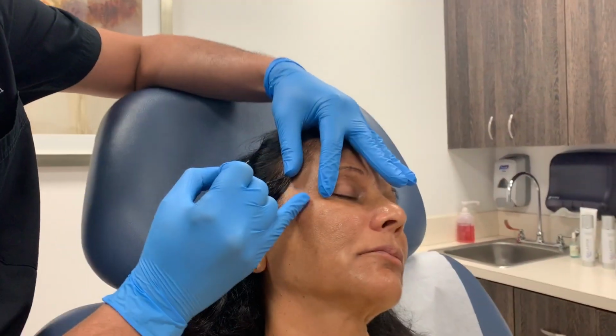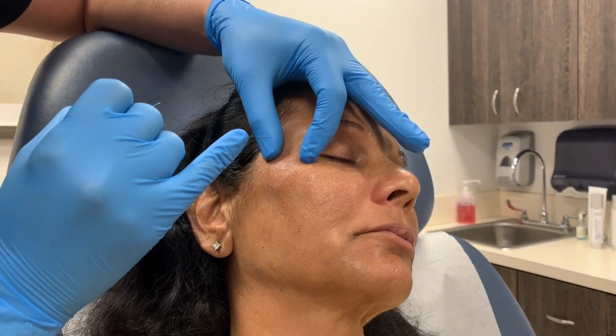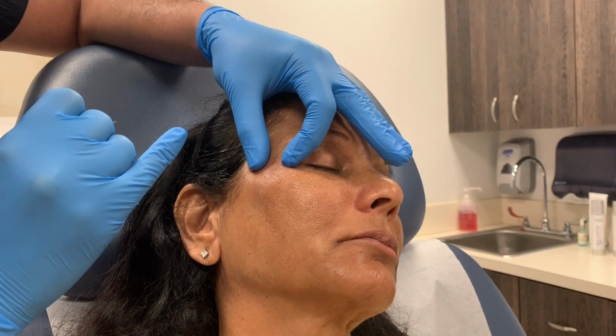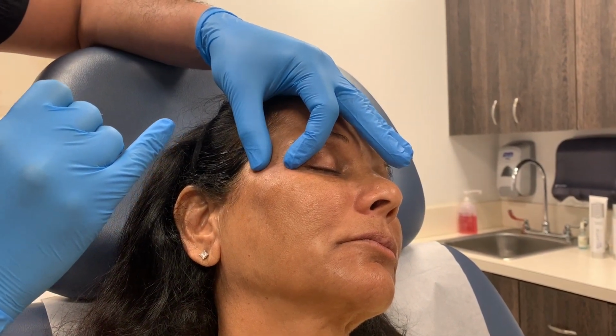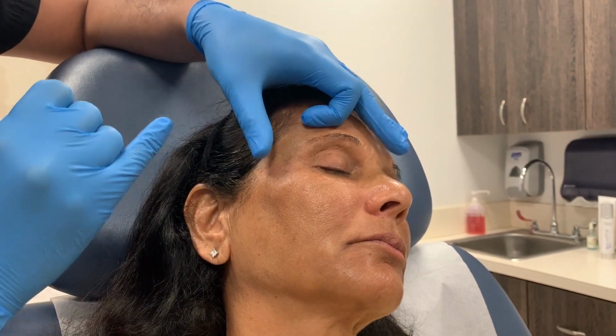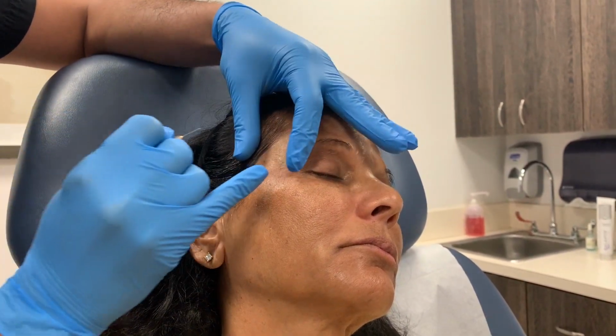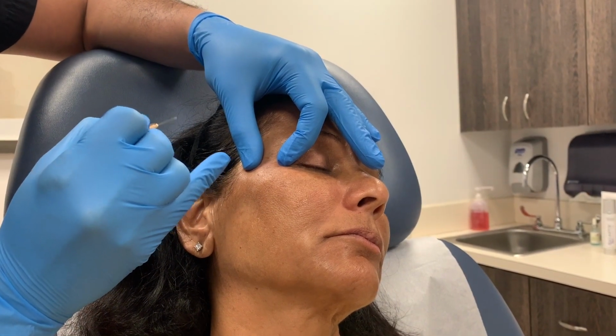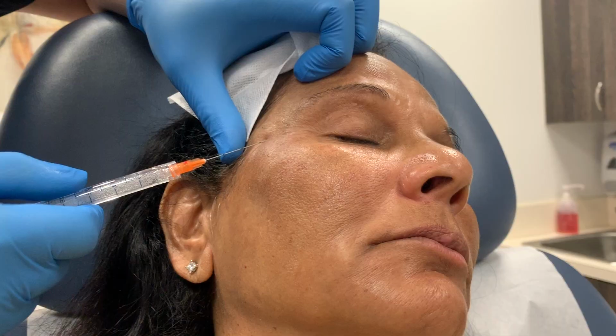So I'm using a hyper-dilute solution of Restylane Defyne. I've pre-blended the Restylane Defyne with 1 cc of bacteriostatic or preserved saline and 1 cc of 1% lidocaine with the 1 cc of Restylane Defyne. So we have a 3 cc solution.